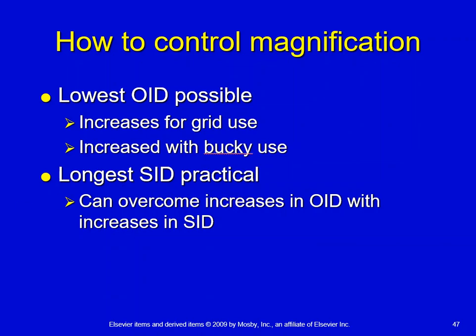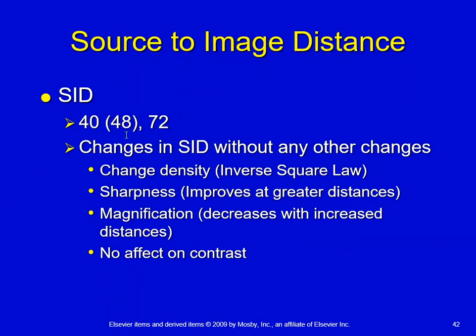So back to where we were discussing the most common SIDs, 40 inches and 72 inches have been the benchmark for my entire career. I don't remember if it was the last edition of Merrill's or the one before, but they tried to kind of change the 40-inch SID to 48 and try to get that to be the established norm, but it just never really took off all that much. So they leave that in the textbook in some cases as maybe a passive-aggressive way to try to get people to increase their SID, but it's just not taking off.